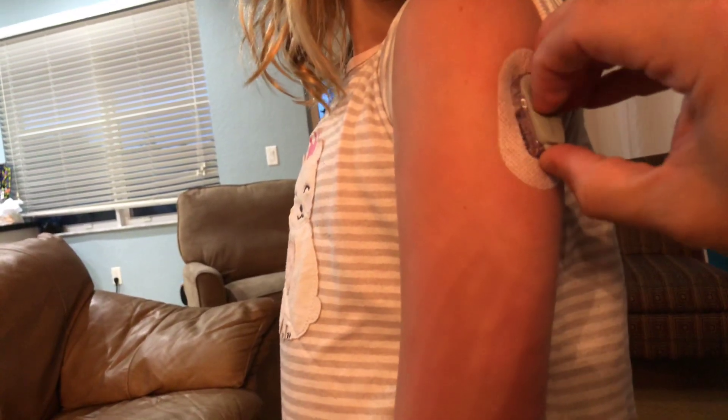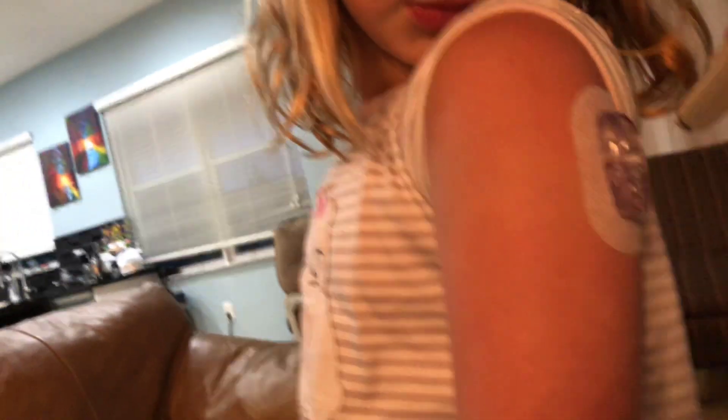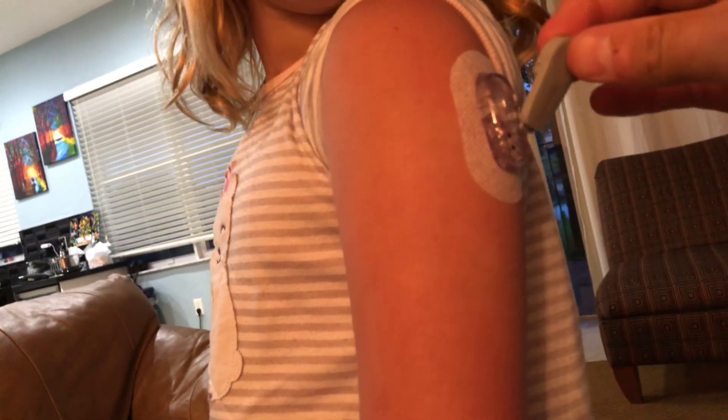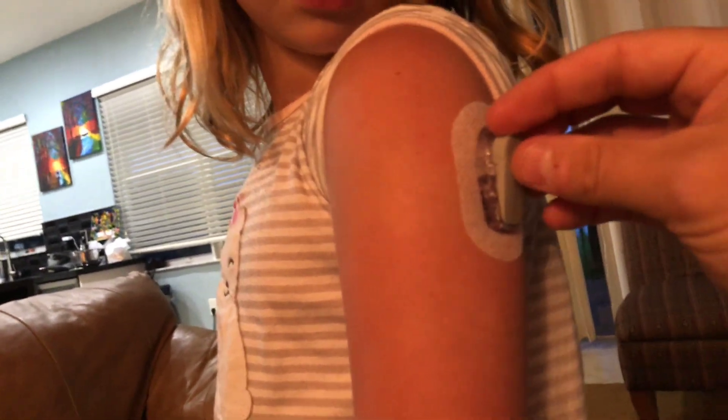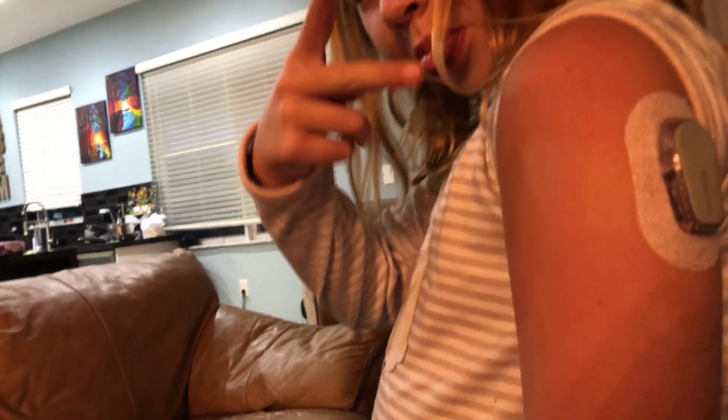You're supposed to slide in this little piece first, but it didn't go in right. So we just pop it out a little bit — watch how easy. Put the little piece in first and click, click. So easy a kid can do it. Kind of.